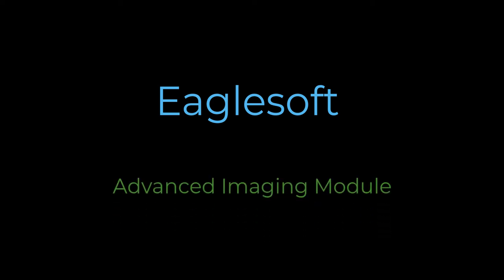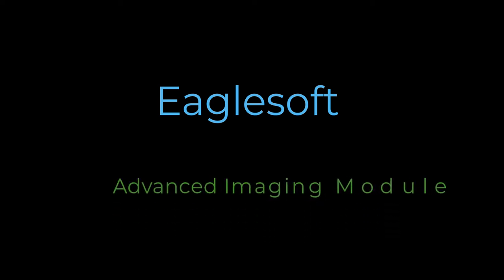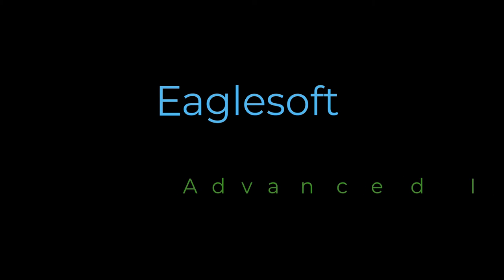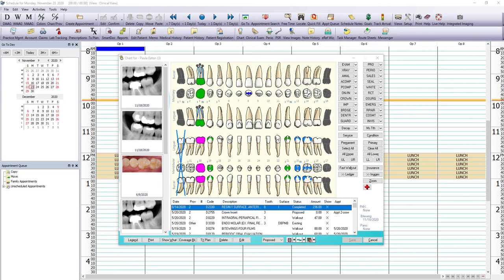Hello, this is Talida, and today we're going to take a look at the EagleSoft Advanced Imaging Module. So first of all, let's take a peek at how we get there, and then we'll take a brief tour.